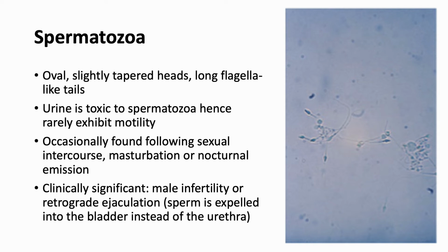So the protocols in reporting presence of spermatozoa in urine vary, so not reporting them may cite the lack of clinical significance or possible legal consequences.